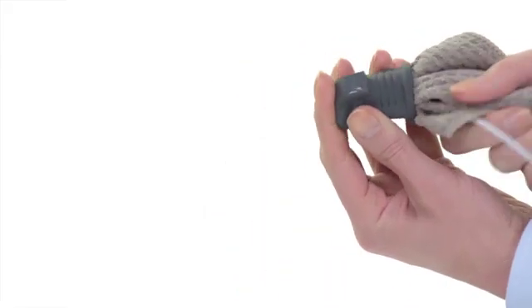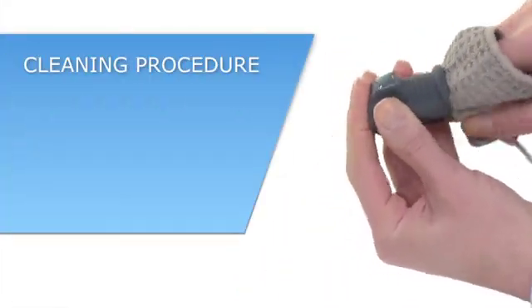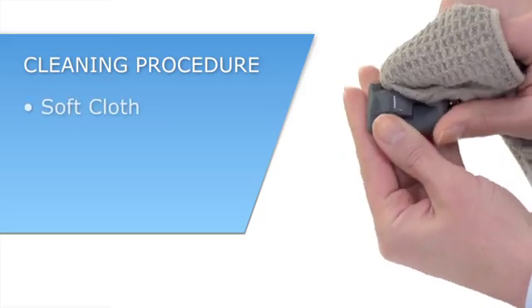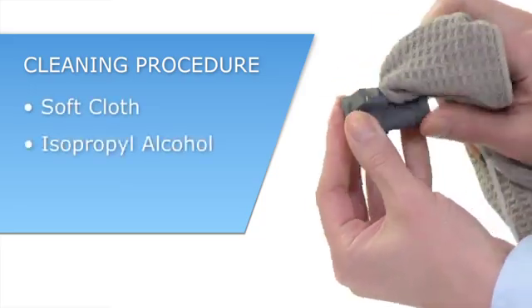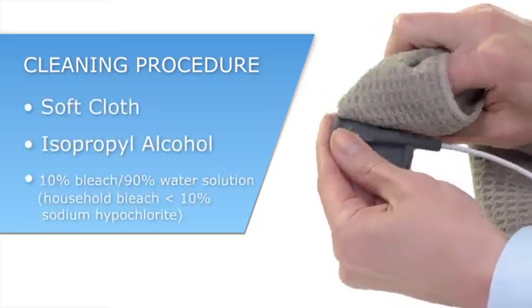To clean between patients, you can wipe all patient contact surfaces of the sensor with a soft cloth dampened with isopropyl alcohol or a 10% bleach solution.